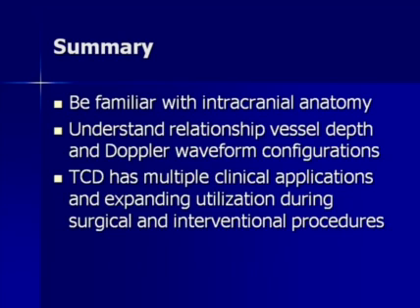So in summary, I think the success at doing TCD is to be familiar with anatomy, understand the vessels, understand what depths those vessels are at, what direction the blood should normally be going in, and that will help as we obtain the Doppler signals. There are multiple clinical applications for transcranial Doppler, and it's expanding all the time, and it certainly has expanded recently to include surgical and interventional procedures.